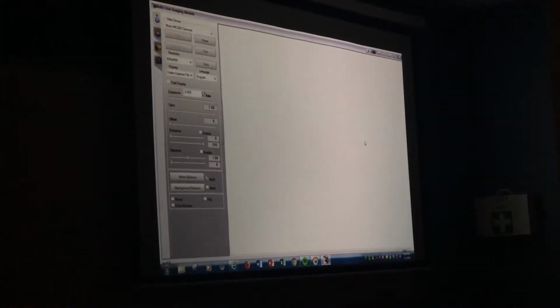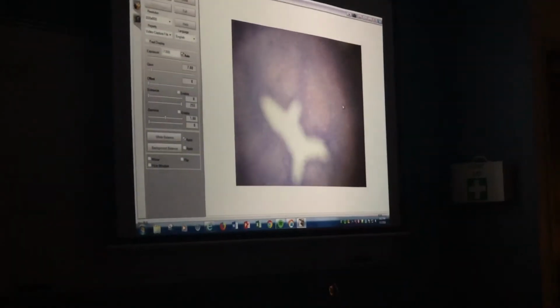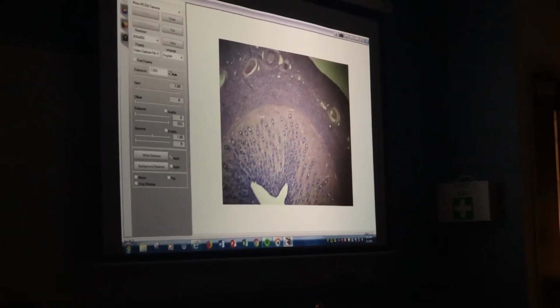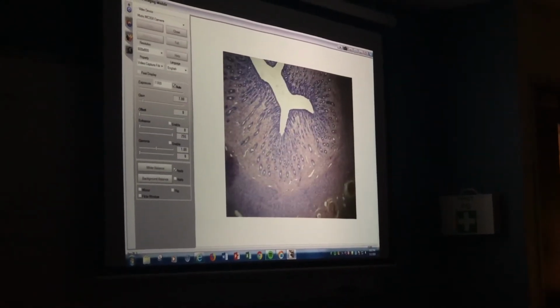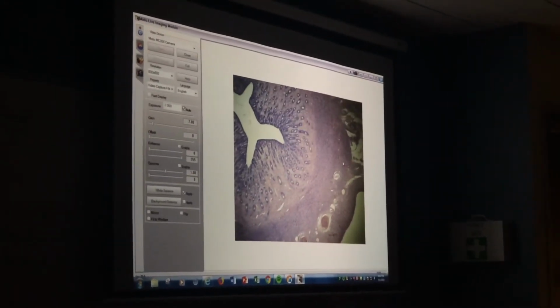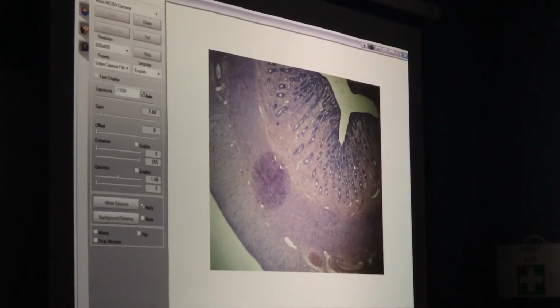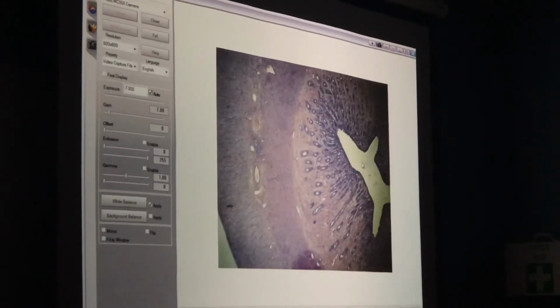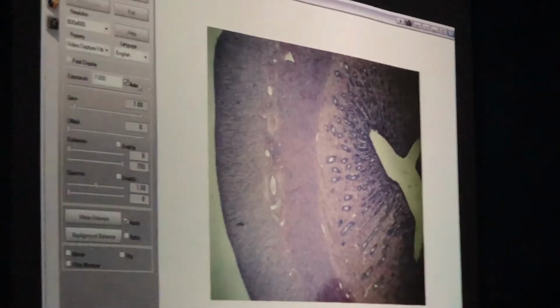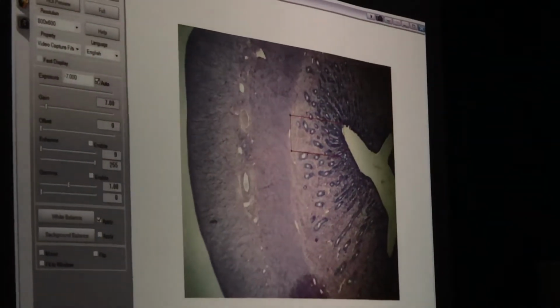All right. Then the last slide that I'm going to show you is going to be the mature uterus. Look at the immature one too, but the mature one is much more interesting, so I'm going to show you that baby instead of the immature. But you'll look at them and compare them when you're done. So, how many layers to the uterus? How many? 3, okay?